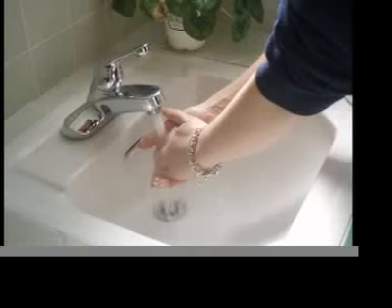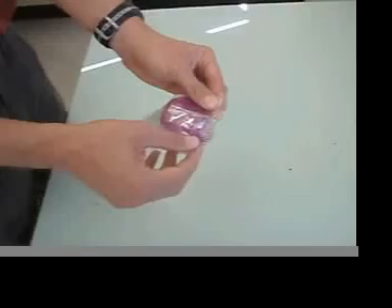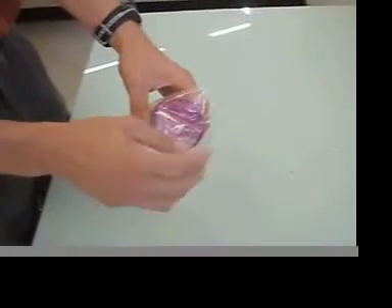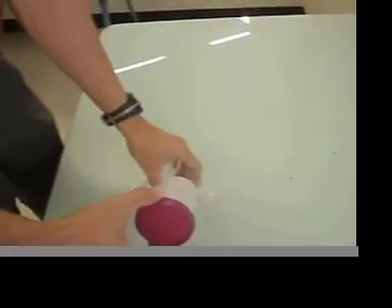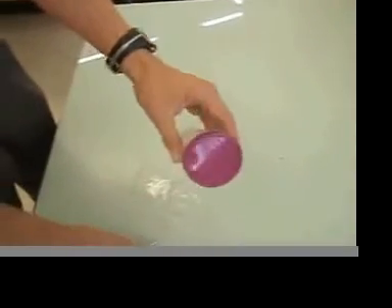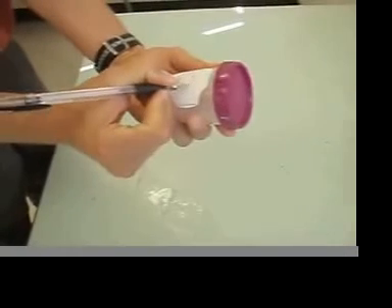Be sure to wash your hands thoroughly with soap and water before you open your package to collect. When you're ready to collect your sample, unwrap your packaging outside the urine cup. Make sure that you write your name and date on the outside.